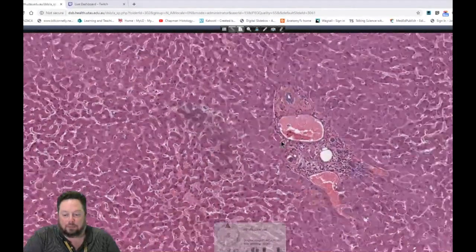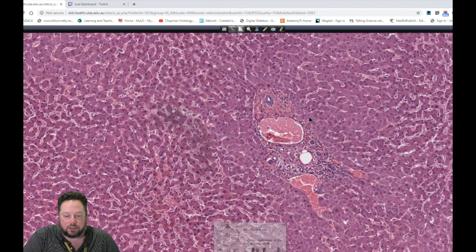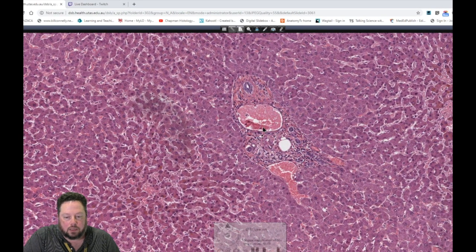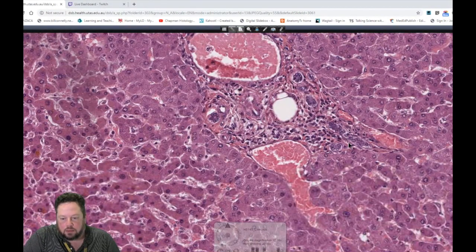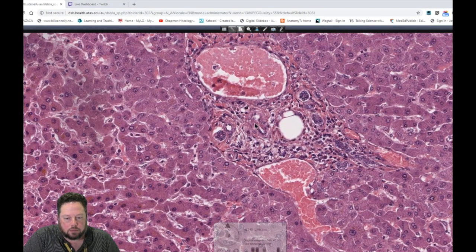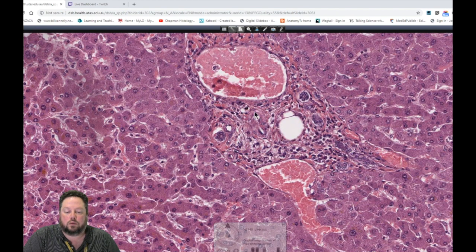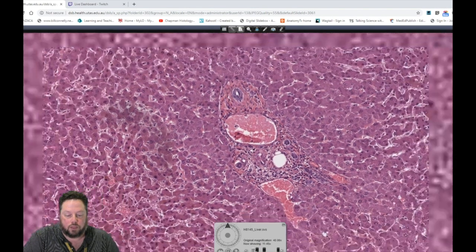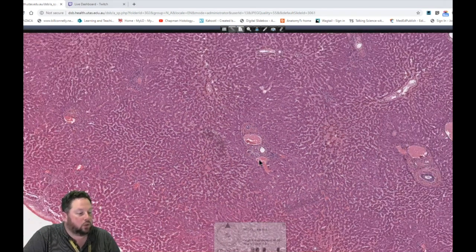Again, we've got one of these regions with the bile duct and the portal vein here as well. I can't see, if I can see the little arteriole there. Maybe this structure here, you can see the smooth muscle. Maybe a little one down there, but the bile ducts are quite obvious compared to the hepatic portal vein branch. All right, any other questions about the liver? We can move on and look at that section of the liver and gallbladder.